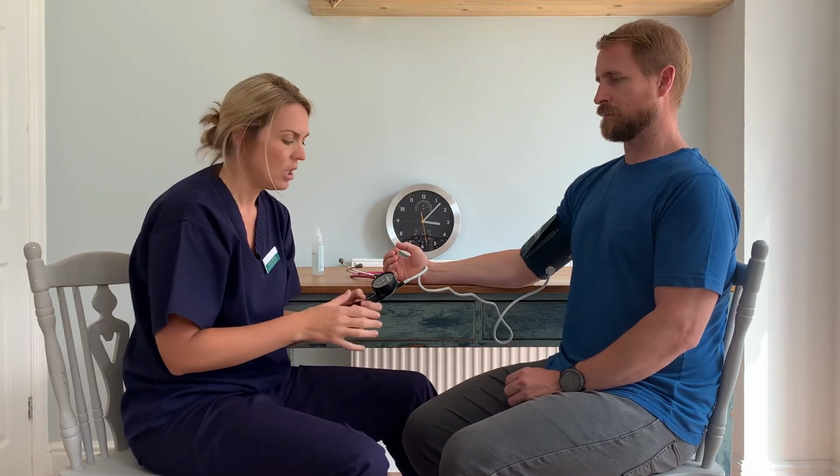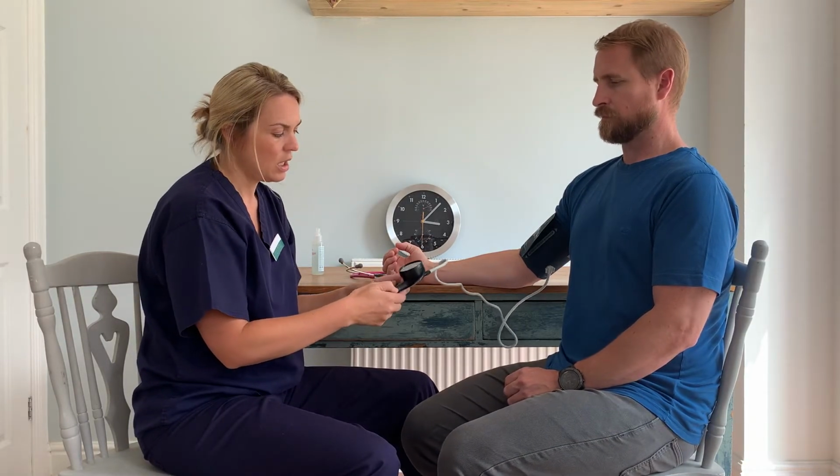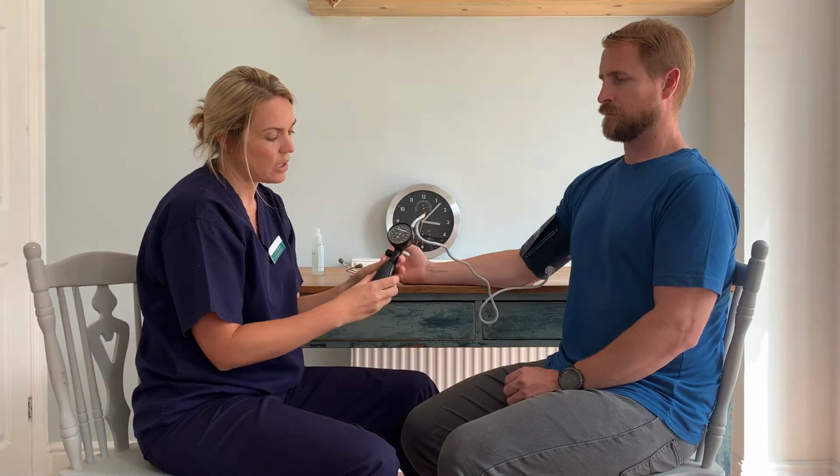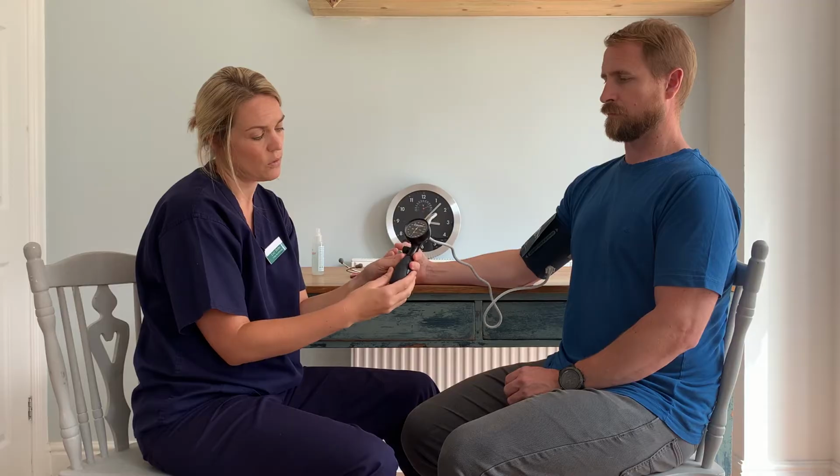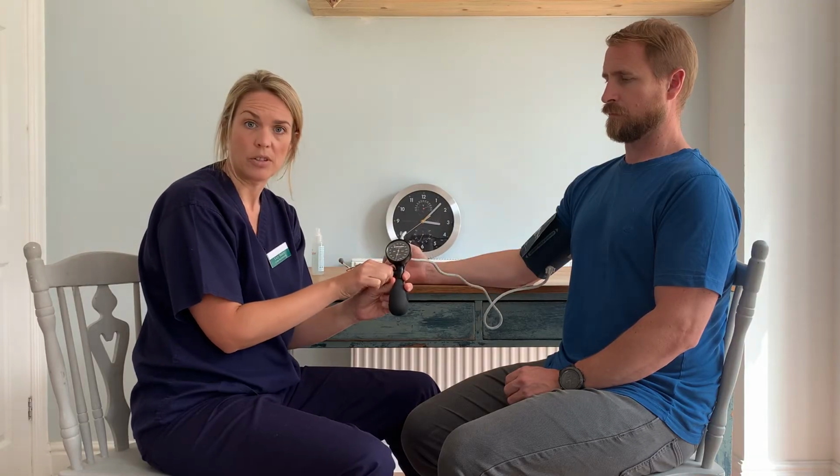So you have systolic and diastolic blood pressure readings. And more information on what this means can be found on the clinical skills information in the OSCE section on Blackboard, if you want to read into this further. So we've got the pump here, you've got the gauge and the sphygmomanometer, and you've got the pump at the bottom, and you've got the dial on the side.